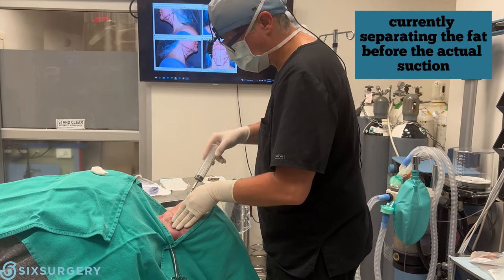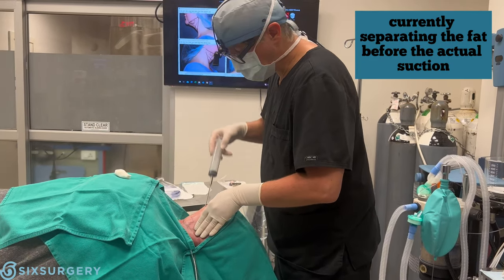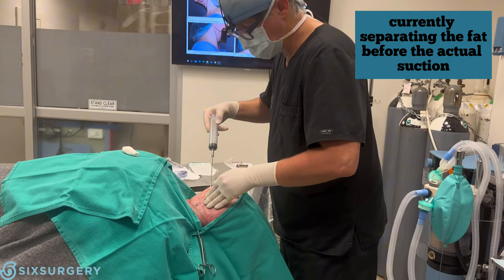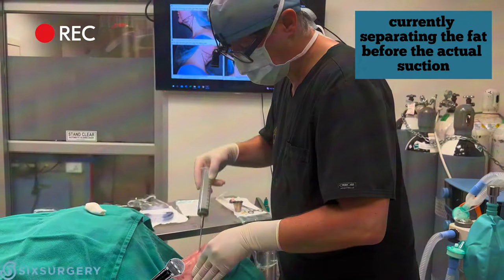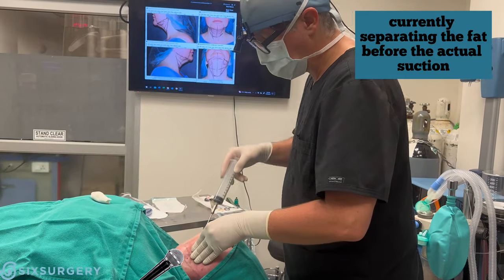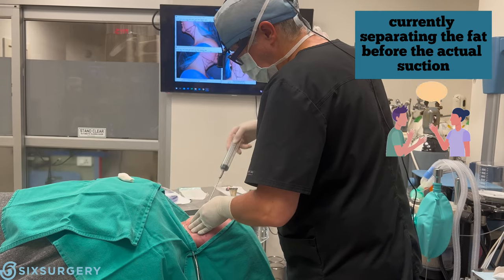For people watching who are curious, maybe terrified of getting this done awake — now that the freezing is in, what do you feel? Any pain whatsoever? No. It's like a bizarre sensation because you can feel it moving through, but other than that, no pain — just unusual. You don't know we have someone poking on you. Yeah, exactly.